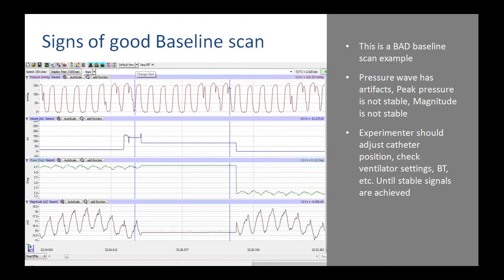That you have a problem with the first channel, which is the channel of pressure, and when the blips are not associated appropriately with dP/dt max and min, the baseline scan originating from this signal will be distorted and will not appropriately capture the baseline taken.